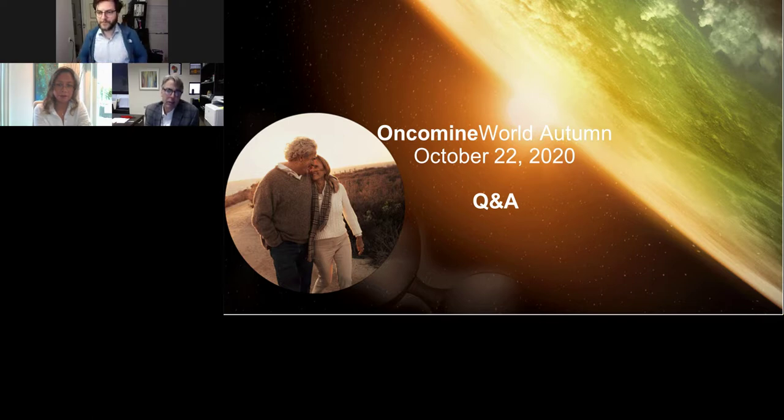Also, and this is maybe at the translational research level, maybe even getting to the clinical level, which might be outside the scope of this talk, some patients you can't get another biopsy from. So blood's the only thing you have to work with. By having a broader panel, that's very helpful. So I do think the more you can do with a blood-based biopsy, the better for your research and the better for translational medicine.